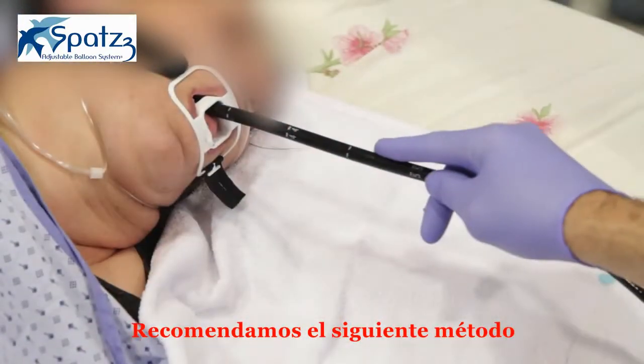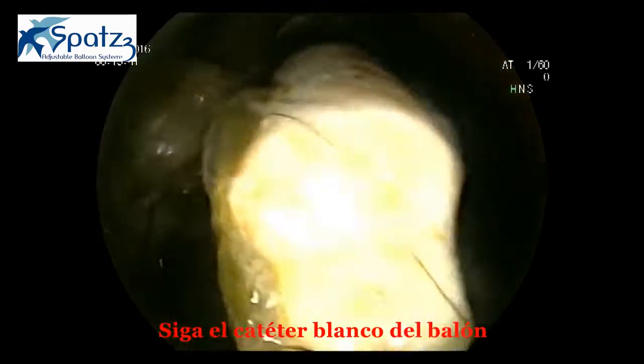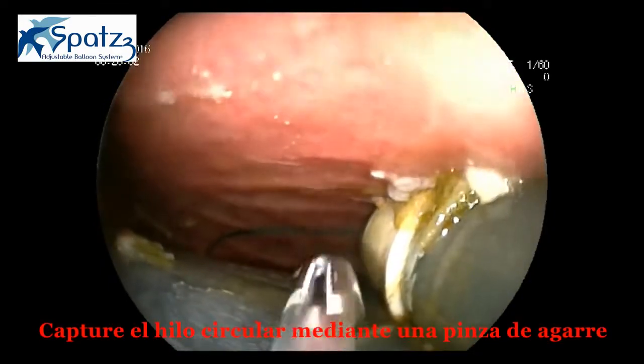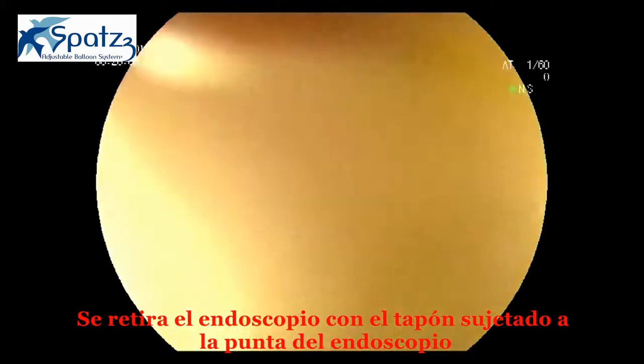We recommend the following method. Endoscopy is performed. Follow the white catheter from the balloon until you reach the valve and cap. Capture the loop with the grasping forceps. The endoscope is removed with the cap pulled to the tip of the endoscope.